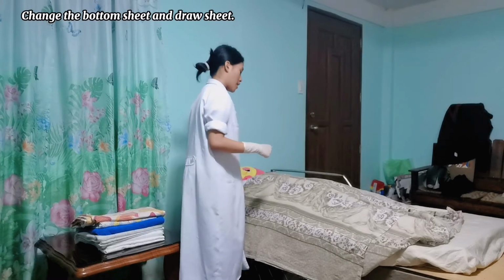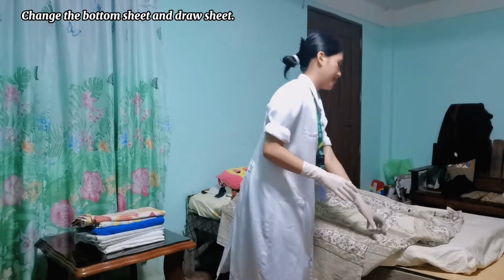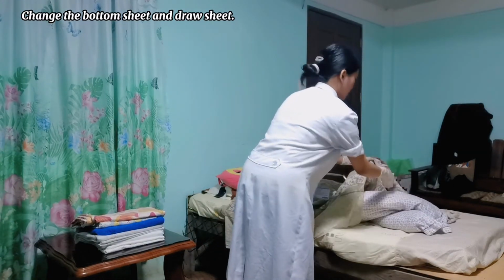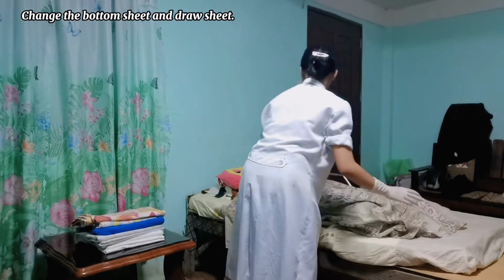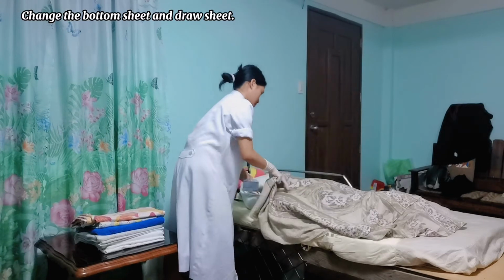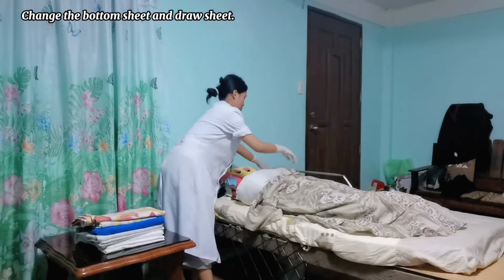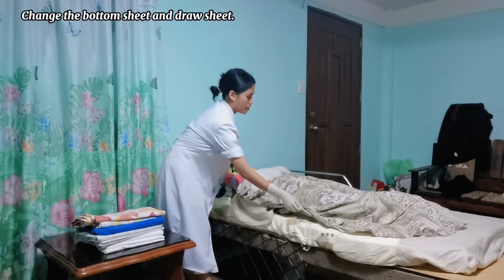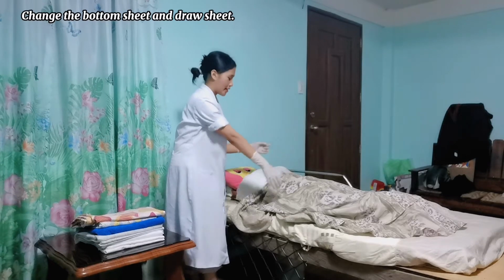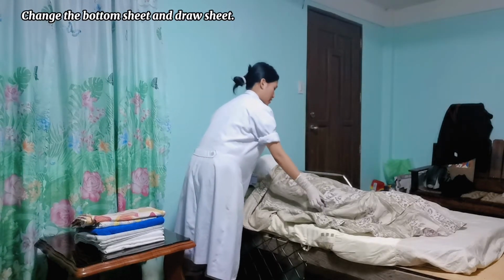So sir, we're going to cross your legs. And your arms. And then help the patient to roll over on the other side. So, be moving, sir, on the other side.